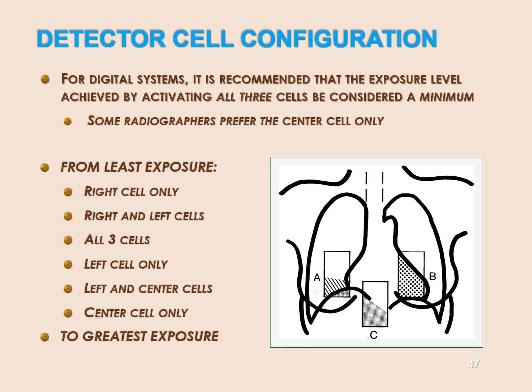Not only that, but he's centered way too low. Okay, he's supposed to center at T7. Right, he's centered probably at T9 for this, based on the location of the chambers. So he's clipping the apices too. But that would also mean that a much smaller chamber would actually be in the lobes, in the upper to middle lobes of the lungs. Okay, B is still going to be superimposed. The bottom corner of B is still going to be superimposed by the left ventricle, but it's not going to be like this. It's centered somewhere between 4 and 6 inches too low.